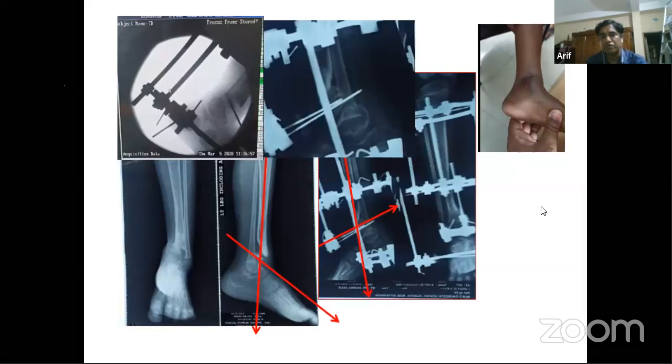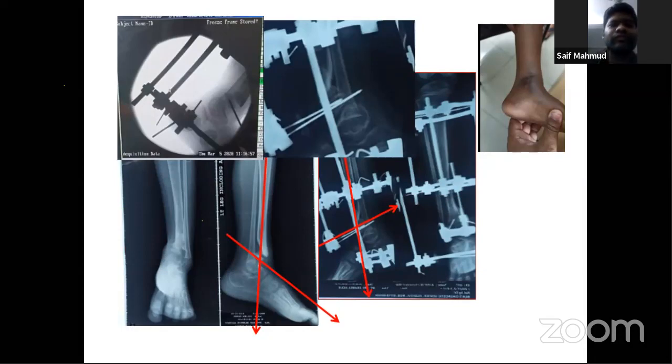At first everyone thinks that the physis is gone, but if you see the upper picture, there is ossification here, and also there is activity of the physis. So we preserved the remaining part of the physis with this very less traumatic technique, Ilizarov, and it corrected the deformity also.